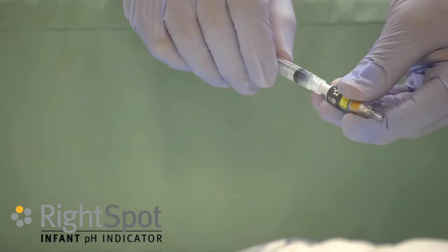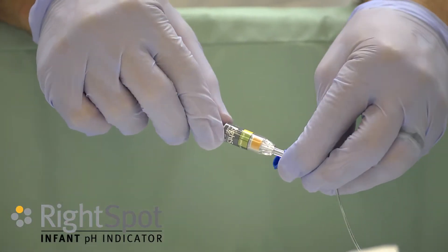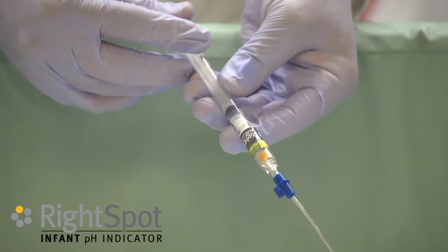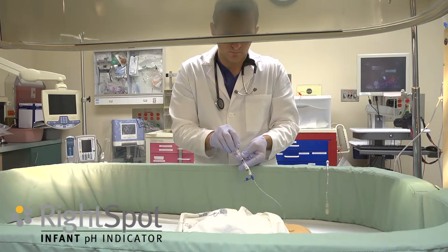Attach the syringe to the Right Spot Infant device. Open the NG tube and attach the Right Spot Infant device. Insufflate 0.5 mls of air to remove the tip of the NG tube from the stomach wall. One can auscultate over the epigastrum during this step.